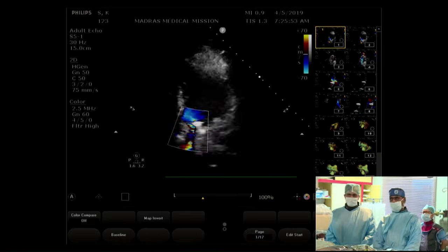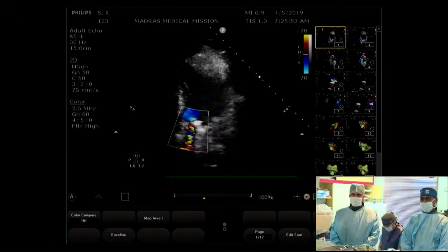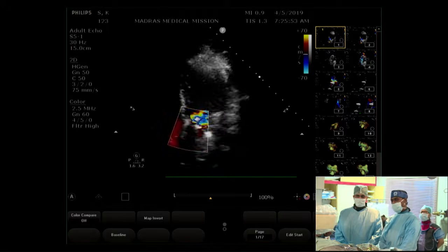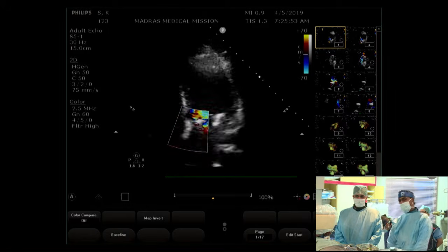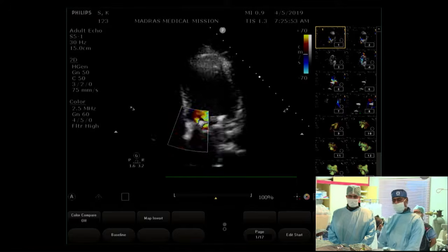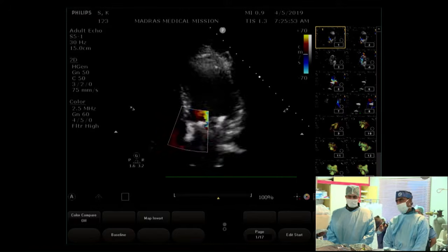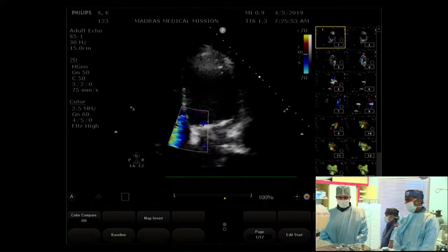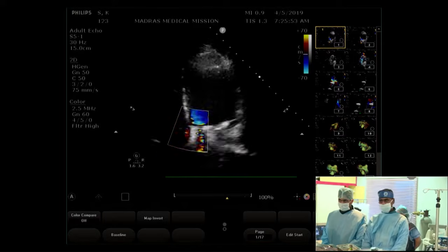Jerry used the very tight angle between the septal puncture site and the paravalvular leak, which is the precise explanation of how tough it is for a leak that is very close to the septum. Now Dr. Srija is going to tell us how she plans the echocardiography. Dr. Srija, please. Good evening.